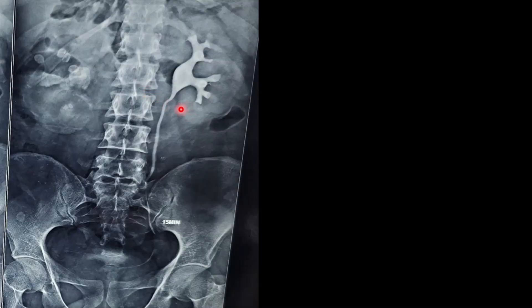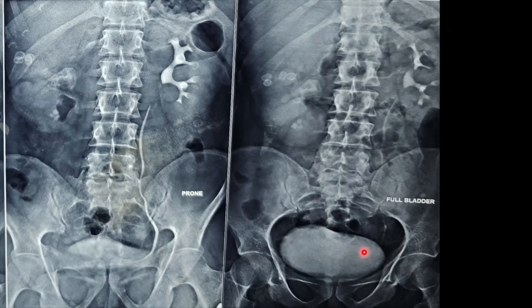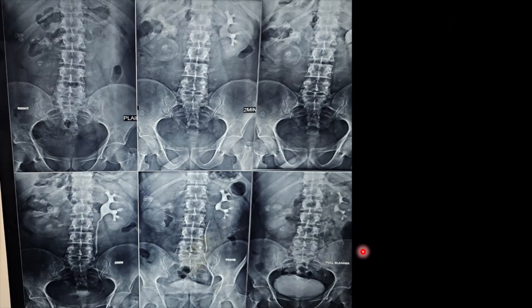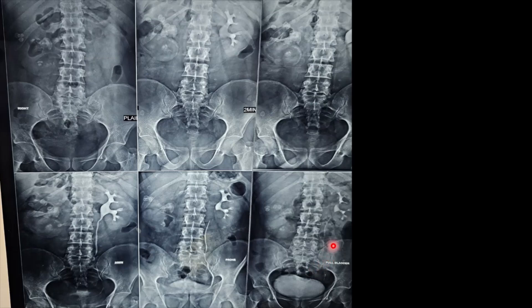From 15 to 20 minutes you can see the ureter, and then finally the bladder. After approximately 20 to 25 minutes, the patient is asked to void and you look for any residual urine in the bladder. Since it is an X-ray, you get a two-dimensional image, so it is important to take oblique views as well to see the location of contrast abnormalities — whether they are anterior or posterior — to approximate the diagnosis. Post-void residual urine, if present, can be assessed depending on timing and whether the patient voided fully.